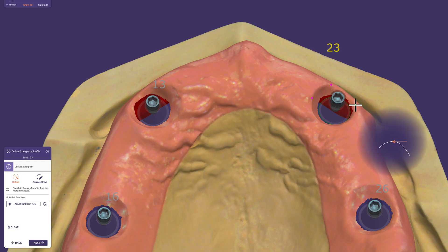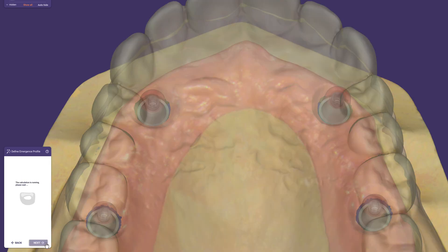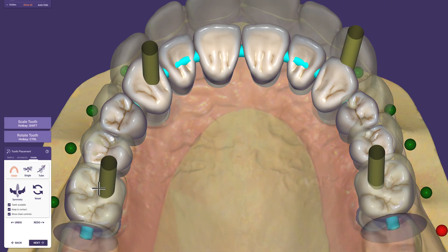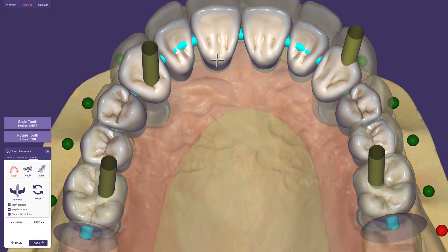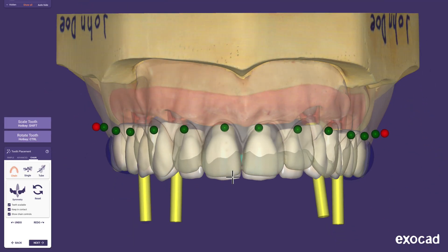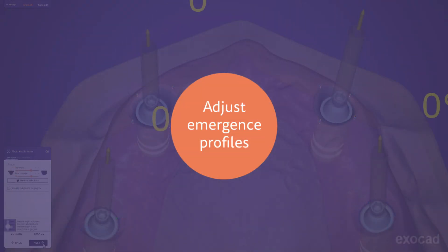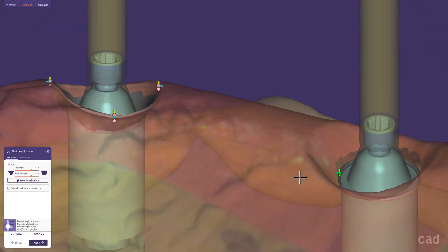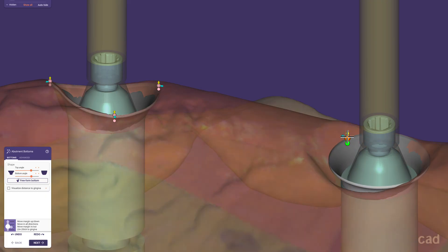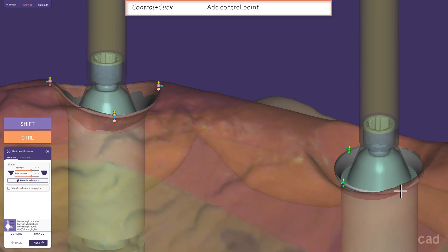Here, 4 points must be set by clicking, which starts the automatic detection right away. For a more accurate assessment of the space conditions, let's make a rough placement of the teeth using the current situation model as a guide. The single control point results in a circular emergence profile. If you want to adapt the bottom to the gingiva, adding more points with a left click while holding Control is recommended.